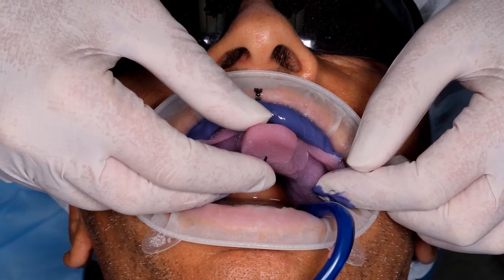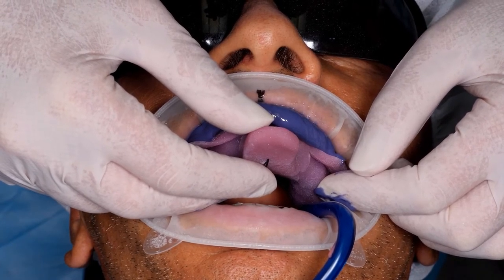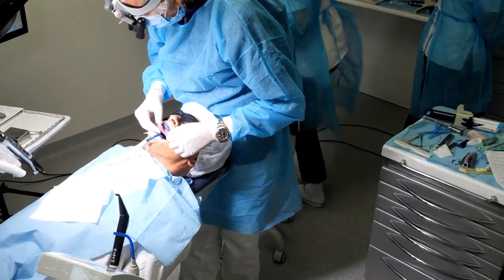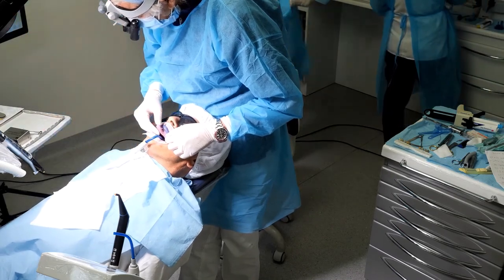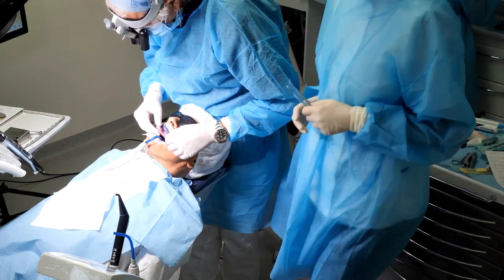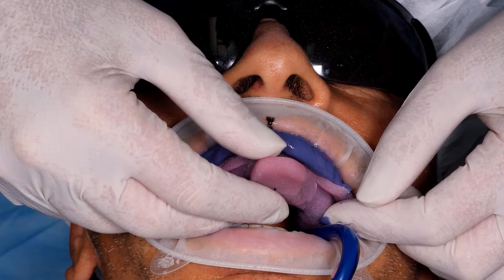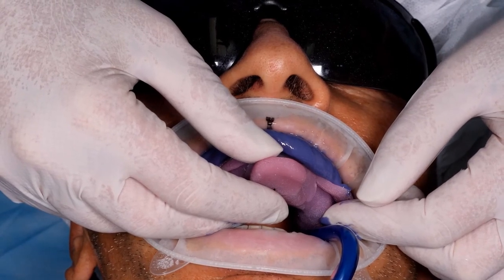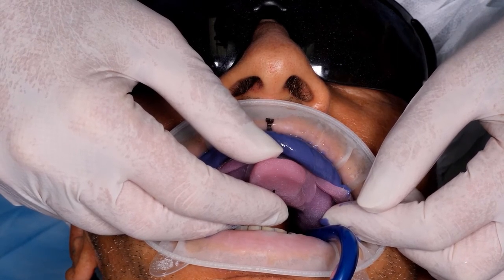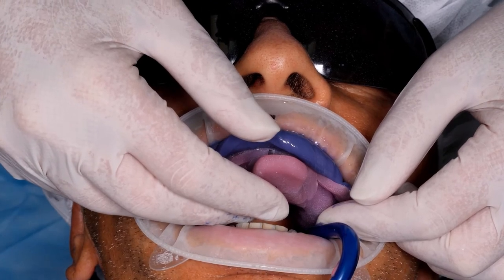We haven't anesthetized the patient at all because we knew that for tooth preparation there would be no problem, with the only exception of some cervical areas where dentine was exposed. But the patient had no problems at all. Cord placement, however, was a source of some discomfort for him. We might have anesthetized him, but at a certain point I understood he declined the offer, saying that he didn't need it. Clearly, later on, if you start to feel pain, maybe you're sorry and you understand you did need it after all. I always try to avoid the use of anesthetics, because I try to understand when I'm being too aggressive or too forceful, since the patient shouldn't feel any discomfort. And if he does, I try to be more gentle in that area when I go back to it. The feedback I get from the patient tells me how to deal with the tissues.